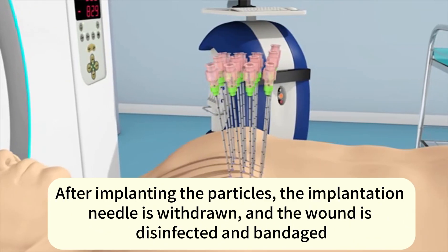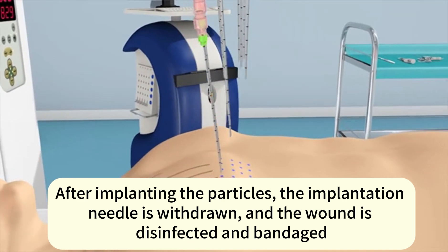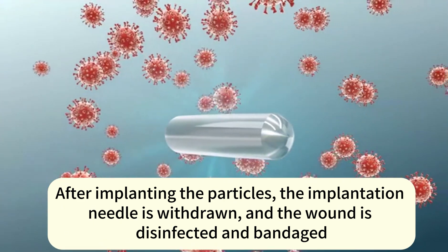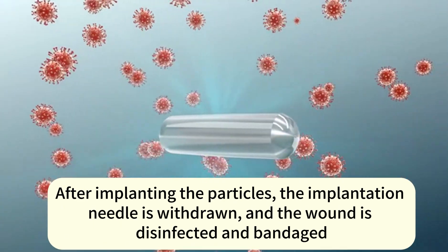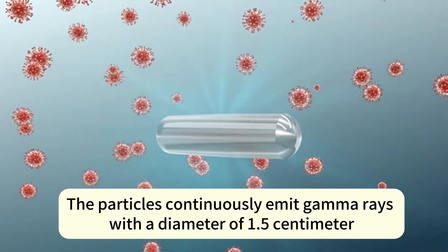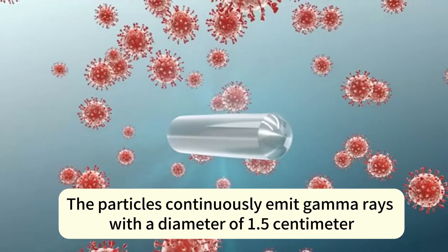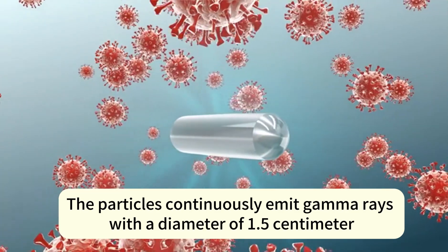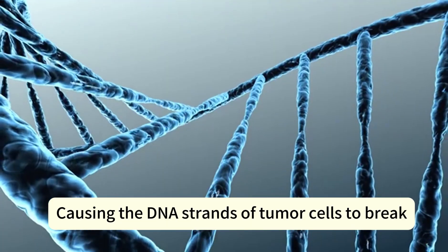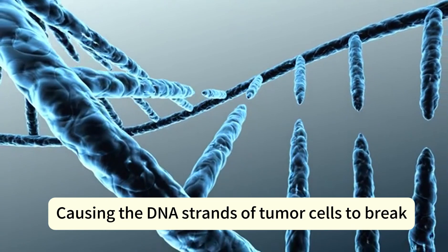After implanting the particles, the implantation needle is withdrawn, and the wound is disinfected and bandaged. The particles continuously emit gamma rays with a diameter of 1.5 cm, causing the DNA strands of tumor cells to break.